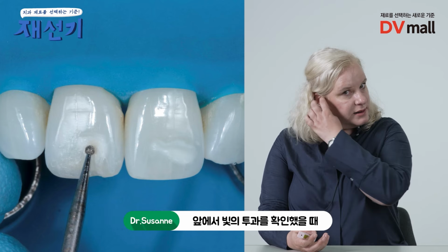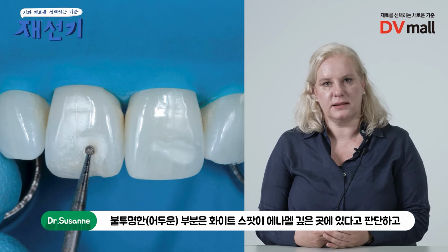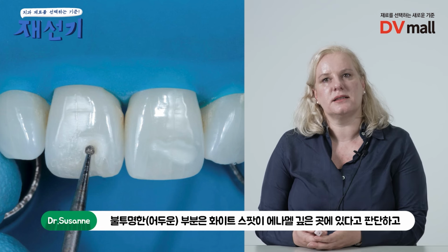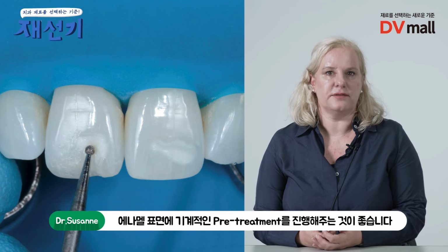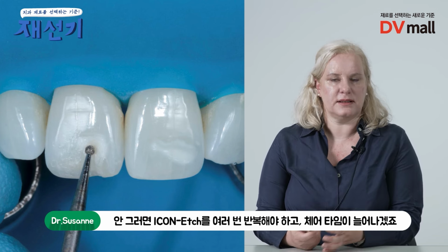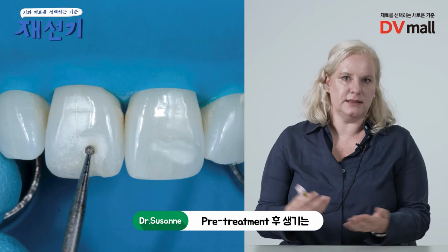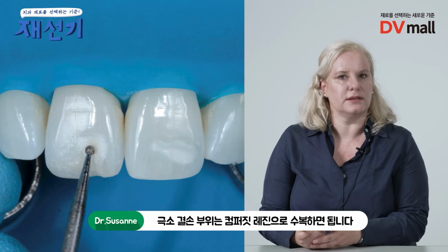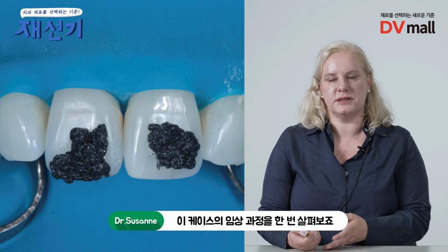In particular, in areas that show surface breakdown or particularly thick surface layers, it might be helpful to do a mechanical pre-treatment of the surface area, because otherwise you need to spend a lot of time repeating etching cycles, and anyway, since the surface was defective in that area, you're gonna cover this up with a little bit of composite in the end. So here we see the clinical procedure.